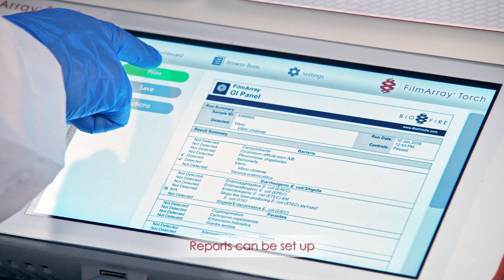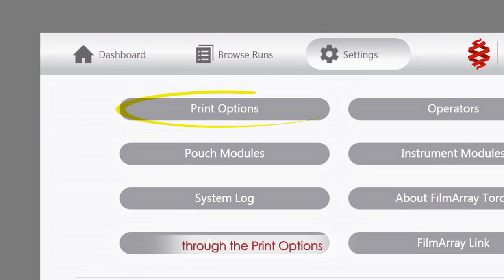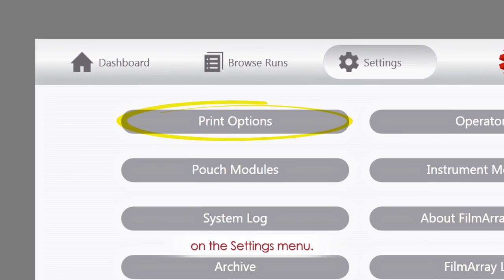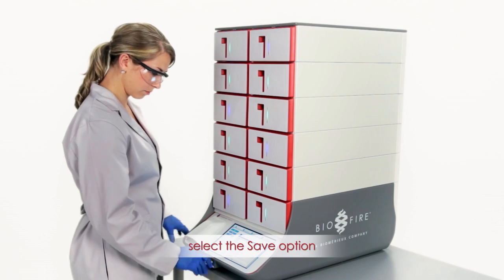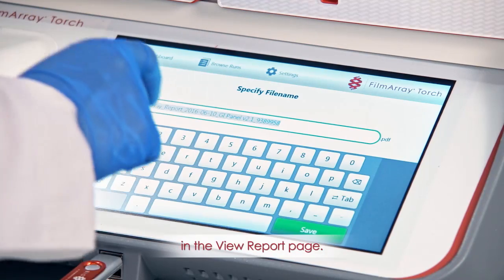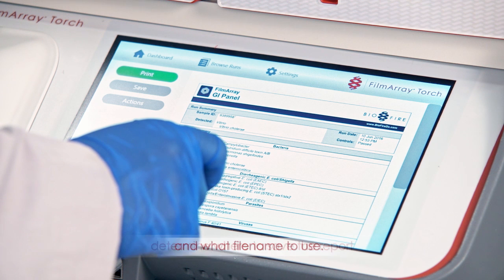Reports can be set up to automatically print to a connected printer by toggling the Auto Print Report option through the Print options on the Settings menu. To save a report to a PDF file, select the Save option in the View Report page. When prompted, determine where to save the report and what file name to use.